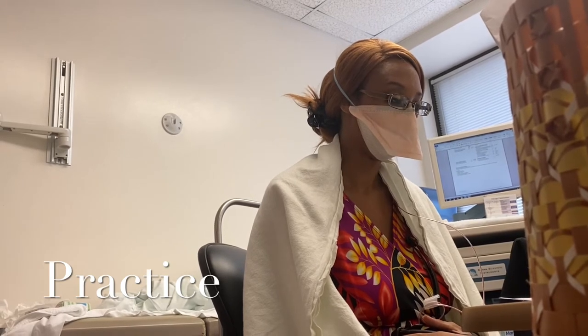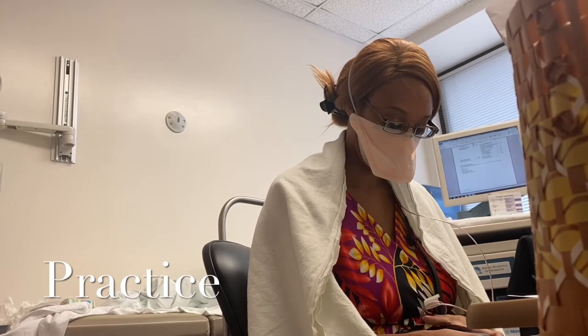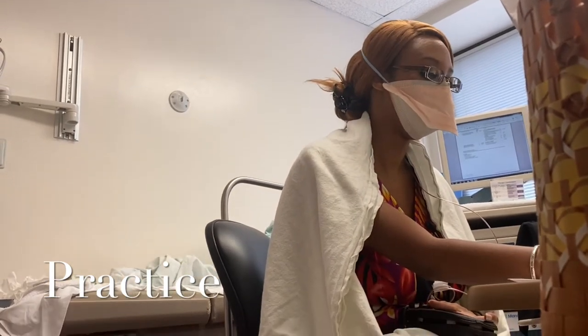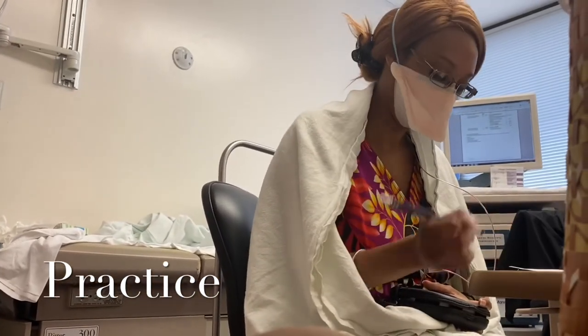So now we're going to say you're having chest pain. Push number two, please. What time does it say? 14:26. So you put 14:26 and a check mark by chest pain. And you see how I put a dash, because we don't want to know the end. We only want to know when it is starting. Any questions on that?